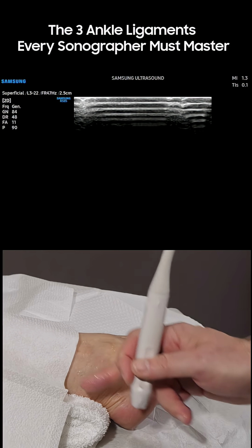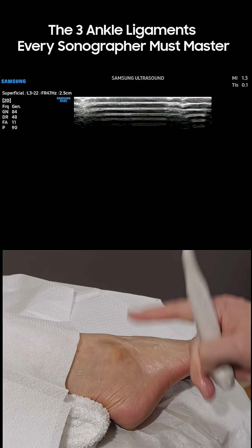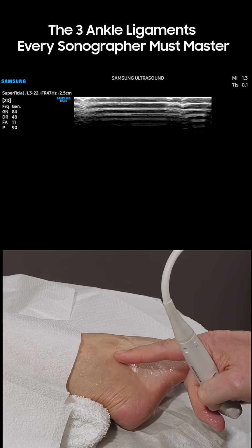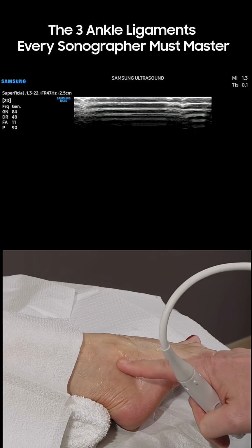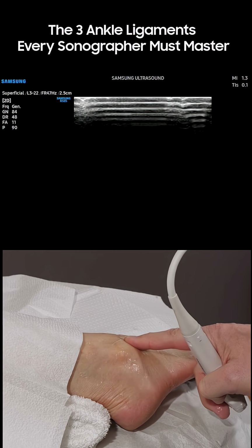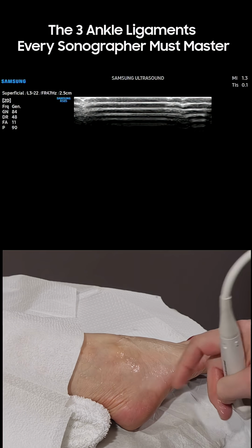There are 5 ligaments in this area, but there are 3 that comprise the majority of pathology. The most common, moving anterior, is the anterior talofibular ligament. That tears in isolation or in combination with the calcaneofibular ligament in about 88% of the population. So that's my first step, starting first with the anterior talofibular ligament.